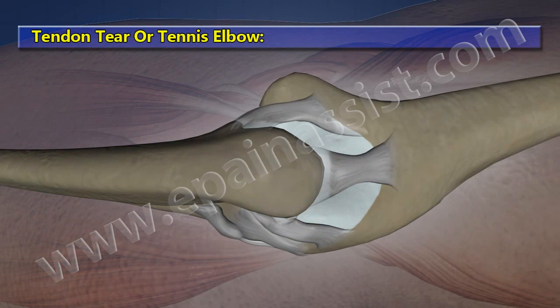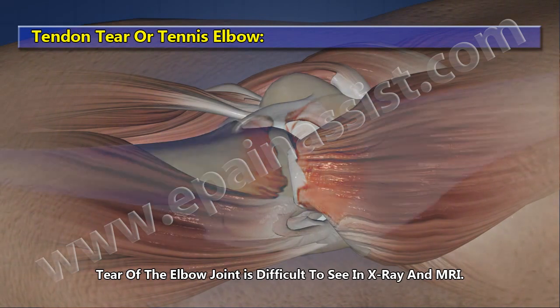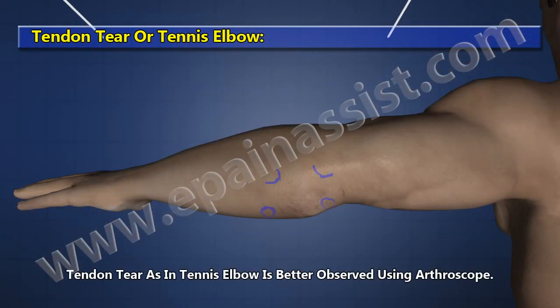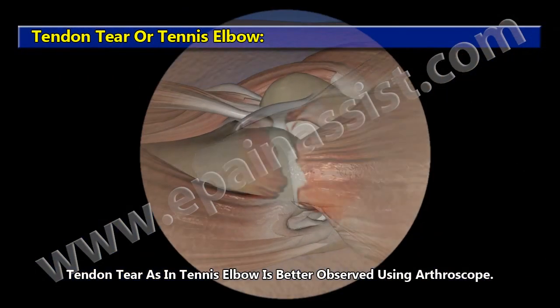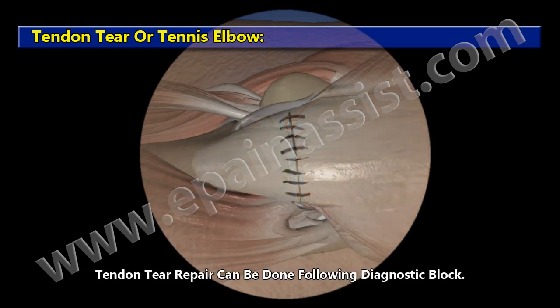Tendon Tear or Tennis Elbow. Tears of the elbow joint are difficult to see on X-ray and MRI. Tendon tears, as in tennis elbow, are better observed using an arthroscope, and tendon tear repair can be performed following diagnostic arthroscopy.